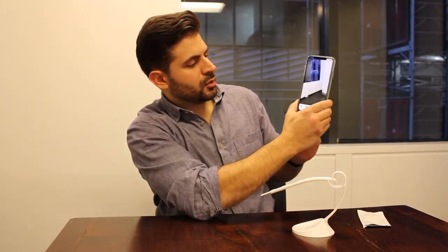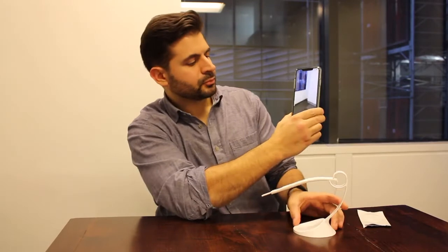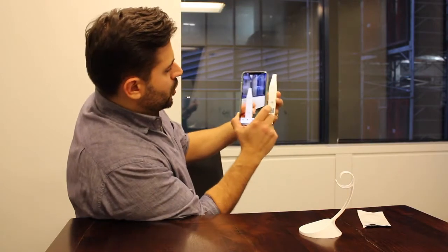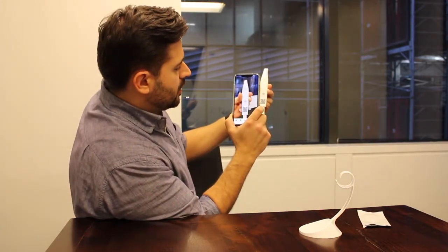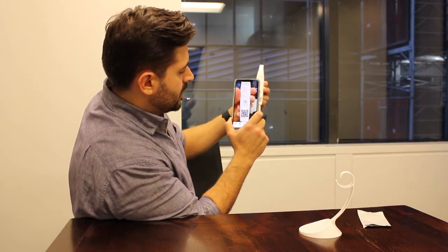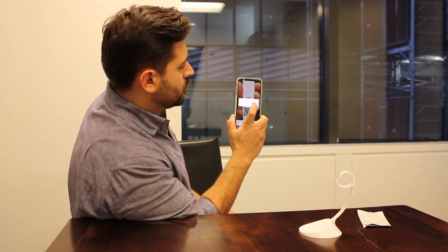When you say that you're ready to scan, you're going to get a camera preview — and there's actually a purple boundary box on the bottom. Once the camera app detects that an Uva test is in sight, that bounding box will turn green. What you're going to do is line up that QR code with the test facing vertically inside that bounding box, and once you get close enough you will capture the results.